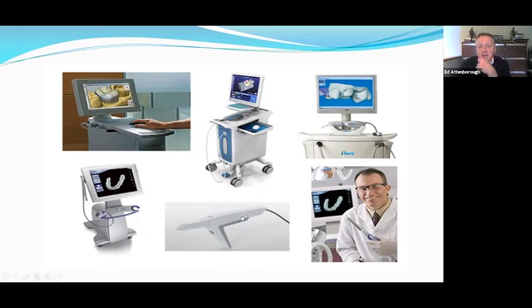So the way these devices work, as I said, is exactly the same as the desktop scanner, but there's a slightly different form factor, which is obviously necessary for comfort of the patient in terms of scanning. So the first thing is that they're all based on a periscope arrangement. If you can see the mouse pointer here, there's a mirror at 45 degrees, and all of the clever stuff, the electronics, is in the handle of the device here.